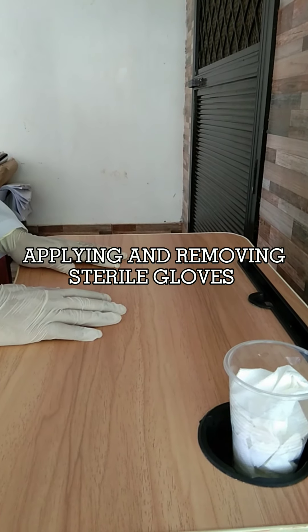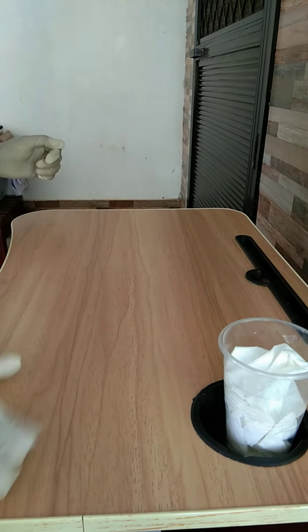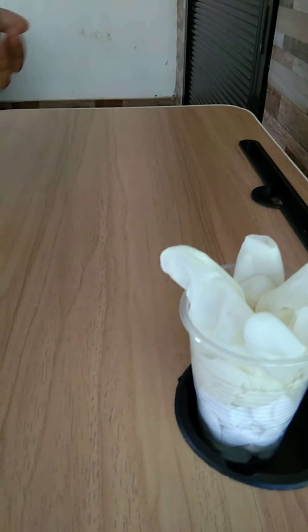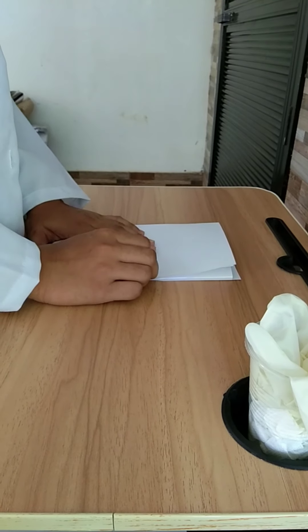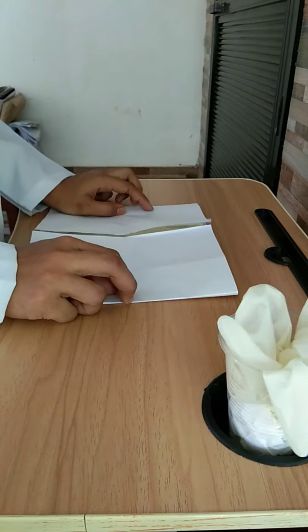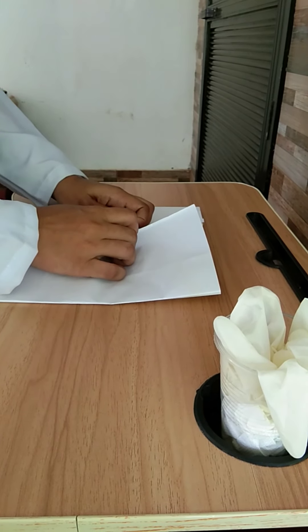Donning and removing sterile gloves. First, put on clean gloves and perform any required cleaning. Remove and dispose of the clean gloves, then practice proper hand hygiene. Remove the outside wrapper of the sterile glove package by peeling the tabs apart where indicated, maintaining the sterility of the gloves by touching only the outside of the wrapper. Grasp the two edges of the wrapper and lift the edges up and away from the gloves, being careful not to touch the gloves as you open the package.